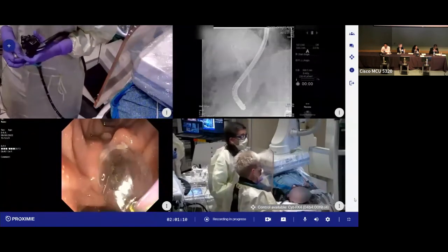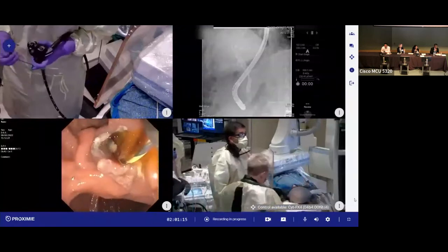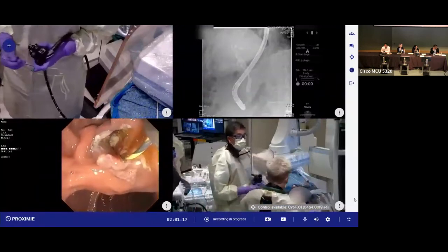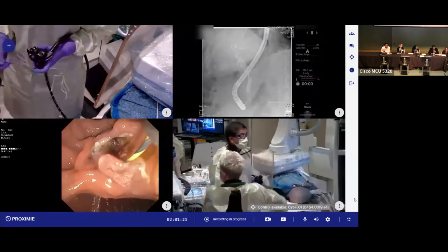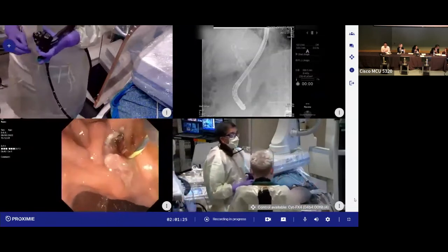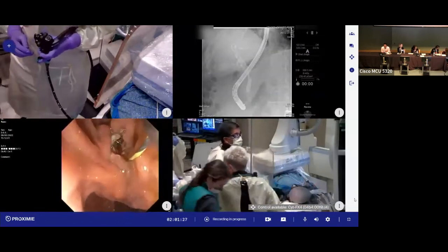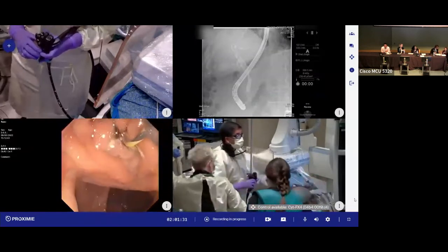Okay, I don't know if you have time for us to see any stones. If you want to go to another room, I'll take all these stones out, and then you guys can come back to see the cholangiogram or something. Raj, we'll stick with you. Oh, you want to stick with me? Okay, all right. Then what we'll do is perhaps we could discuss a strategy for these multiple stones.